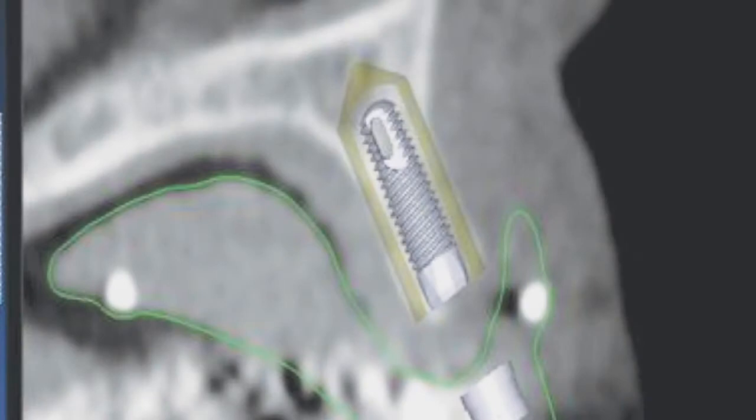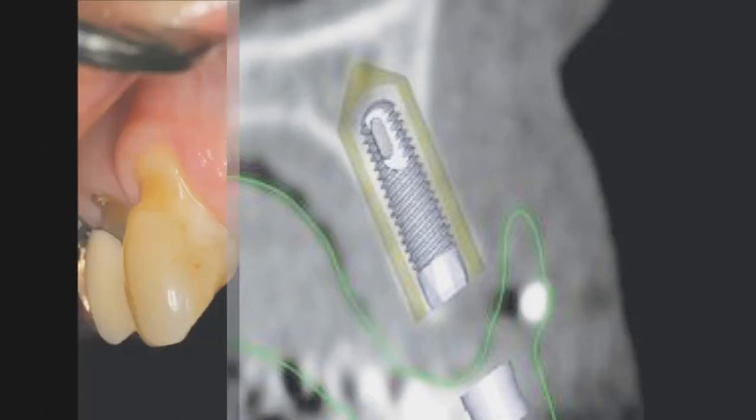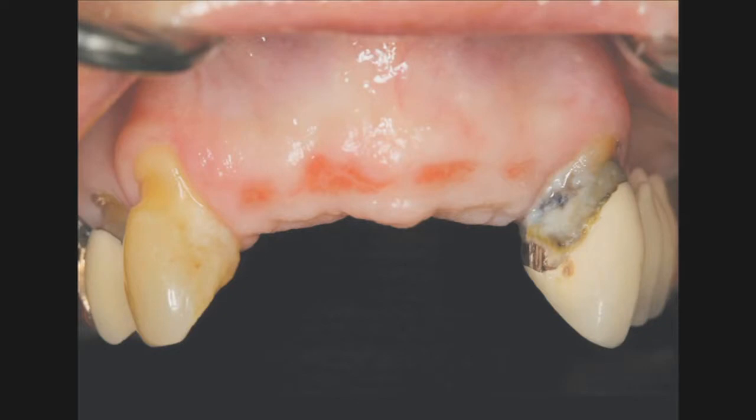Based on this virtual plan and the clinical determination that there was adequate attached gingiva, the cases were done following a flapless procedure. So let's look at the two cases demonstrated here. The first case shows an edentulous anterior maxillary area. 7 through 10 are missing. The right and left lateral and right and left central maxillary incisors are missing.